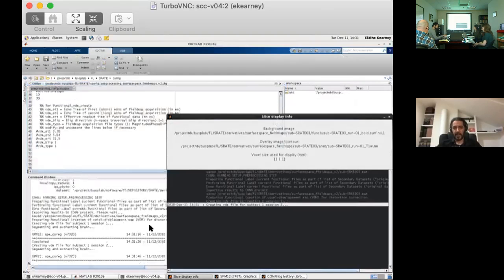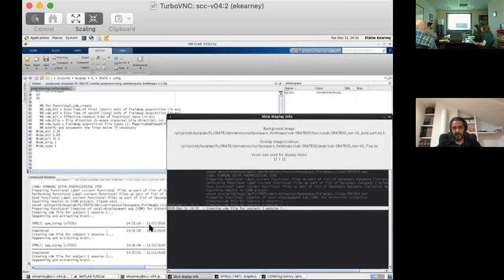Those should be apparent from, at least from the few examples that I've seen, the images of before and after correction. But I don't know to what degree. I haven't had enough experience to be confident from these images to tell you whether those are clearly wrong, or within the acceptable range or not.